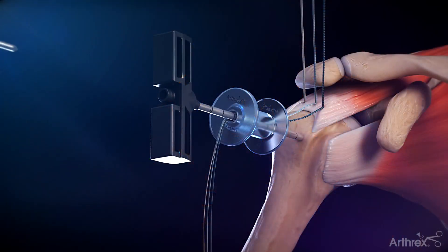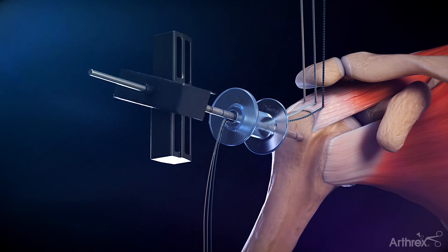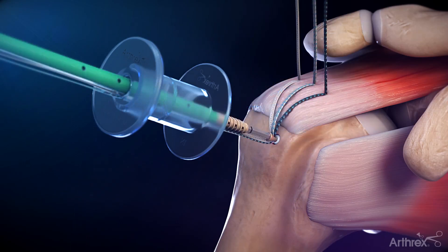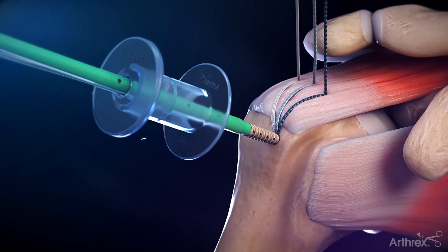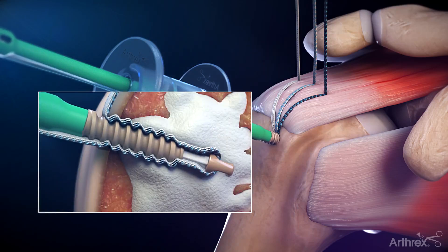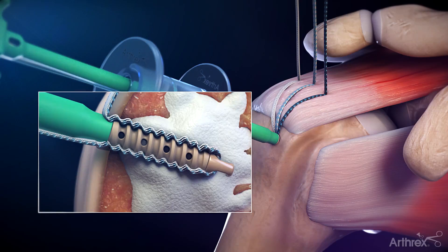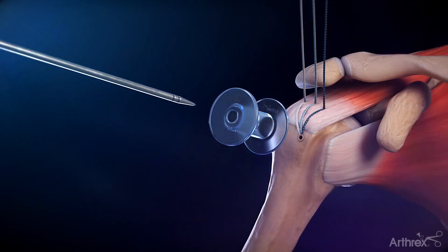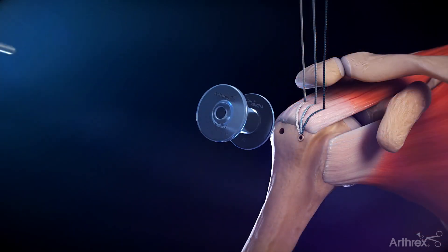The inner trocar is then reintroduced to clear the cannula and deliver all the material. The medial row sutures are passed through the islet of the swivel lock anchor, which is then secured into the augmented bone socket, where the Bone Sync Cement interdigitates with the anchor threads. The same steps are completed for the second lateral row anchor.